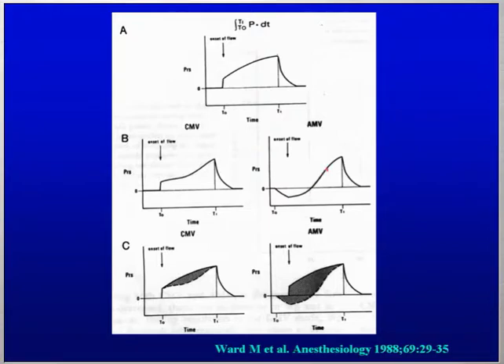And if you compare this curve to this one, you see that there is clearly a major difference, a decrease in pressure during insufflation. This is easy to understand because during this mode, the flow is kept constant, so during the phase the ventilator is insufflating, if the patient is pulling, trying to get air, the pressure at the airway will decrease.